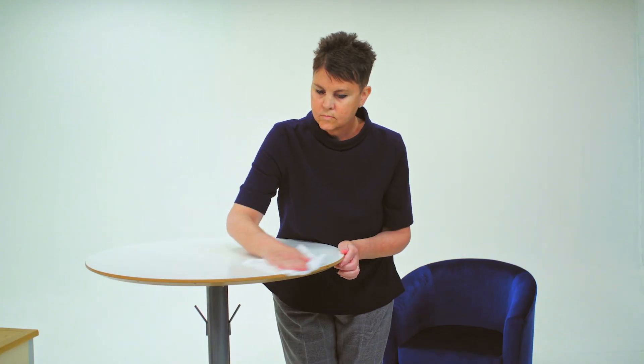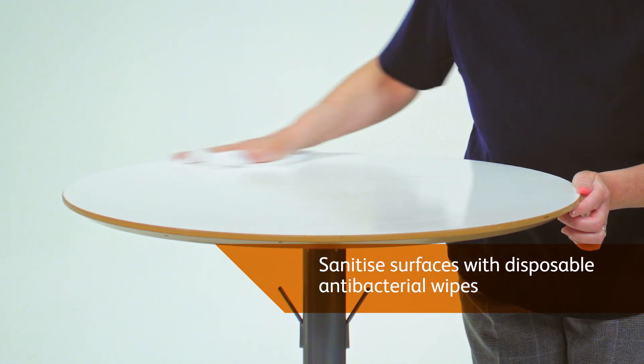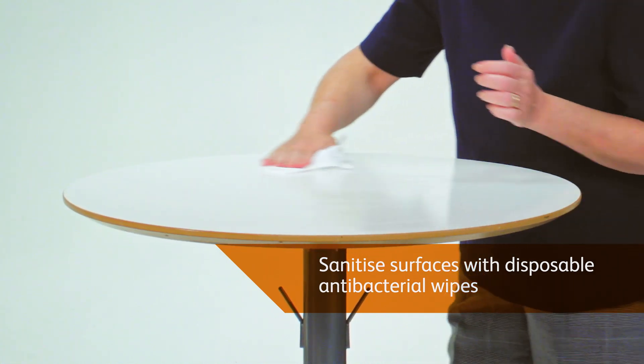Be sure to clear any appliances or objects on your preparation surface. Wipe surfaces clean with hot, soapy water, before sanitising surfaces with antibacterial, disposable wipes. Leave the surface to dry.